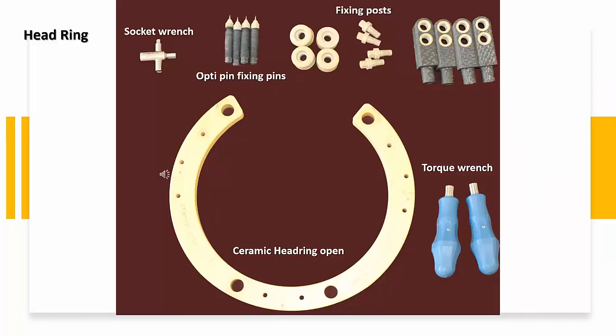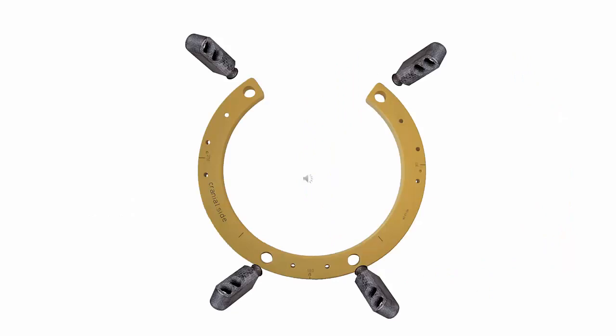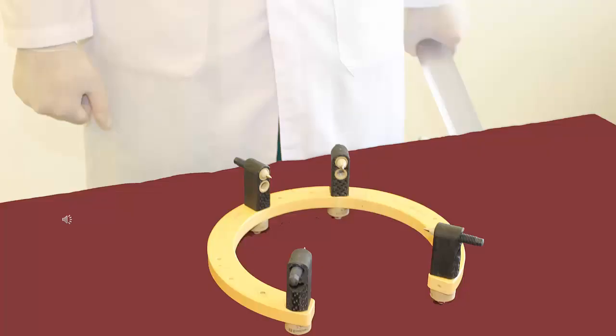You can see the necessary equipment to assemble the headring on the screen. First, we need to take the ceramic headring. There are two sides of the ring: the cranial and the caudal side. We need to put the four fixing posts into the holes and use the screws to tighten it to the frame. After the four fixing posts are implanted, the opti-pins are implanted into the holes of the fixing posts. You can use the upper or the lower holes.